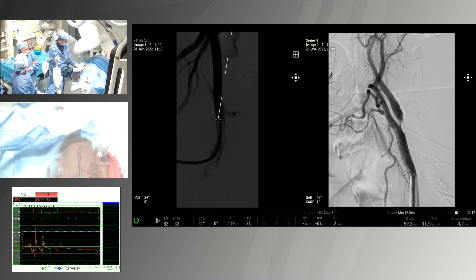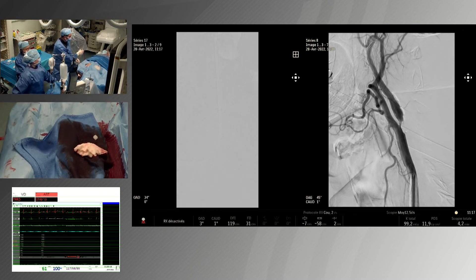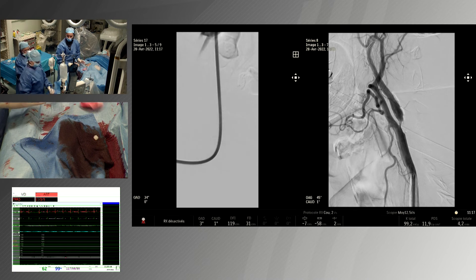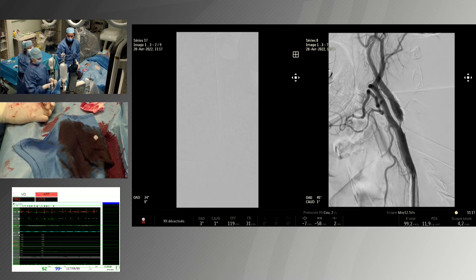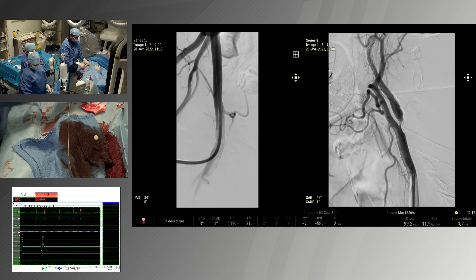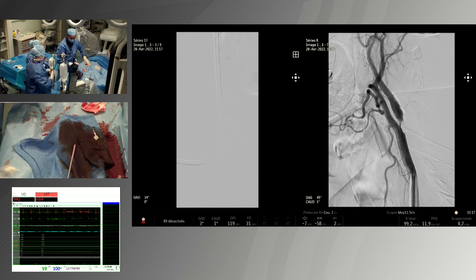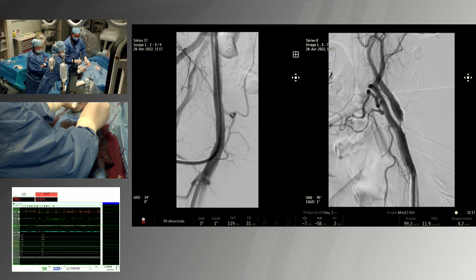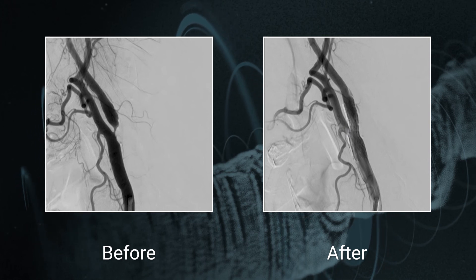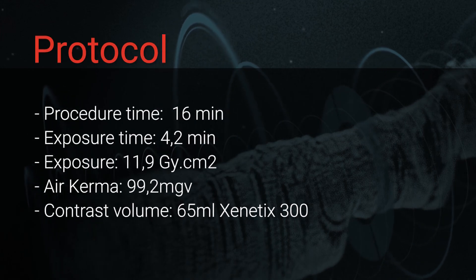This patient was a 70-year-old patient with asymptomatic severe stenosis, treated via femoral approach. We performed the procedure under protection with an EZ Boston filter. We pre-dilated with a 4 mm balloon, placed a 9 by 30 mm carotid stent, and finished with a post-dilatation of 5 by 5 mm. In our opinion, the result was excellent. Thank you.